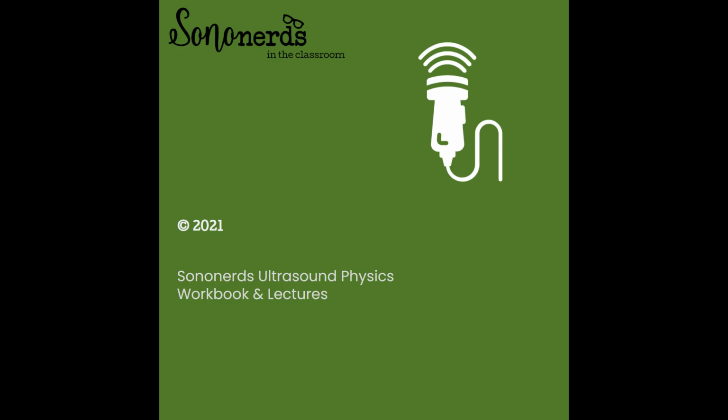And that brings us to the end of our transducer types lecture. Now remember, there is a second section of Unit 12 in which we are going to talk more about that elevational resolution, which I have mentioned a little bit throughout this lecture. We're going to take a closer look as to what that means now that we know what transducers are and what they're doing. But for this part of the lecture, I want you to focus on those 6 transducers: mechanical, annular, phased, linear, convex, and vector. Know the information that is involved in those charts and know how the images are created.